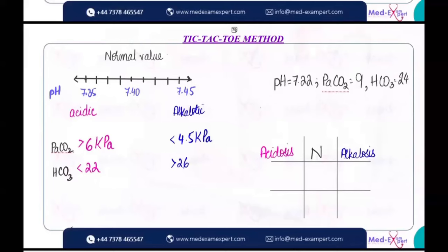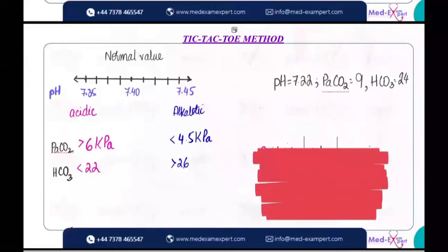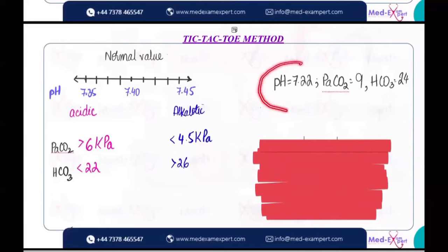When you have an ABG, for example, you have an ABG right in front of you right now. Let's forget this for a moment. If we just look into these values first, you have a pH of 7.2. So what is this pH? I want you all to type it down there. Let me know if you know it. What is the pH here? Yes, this is acidic. Acidosis. Let's use a different color for acidosis.